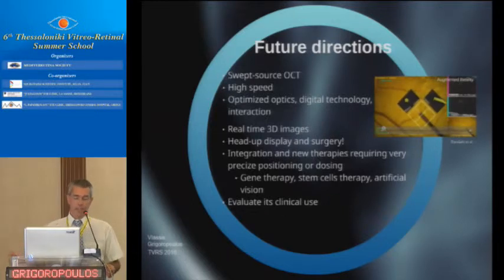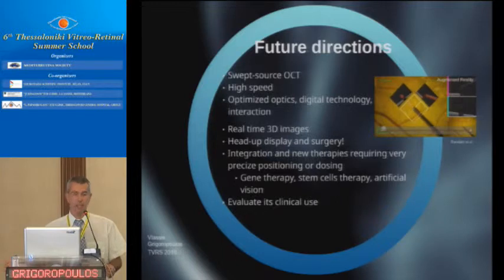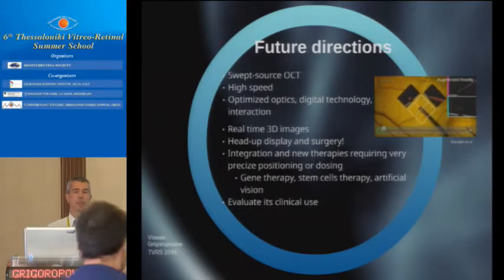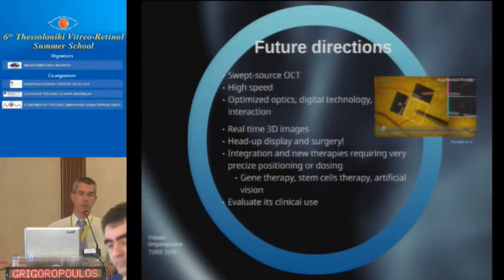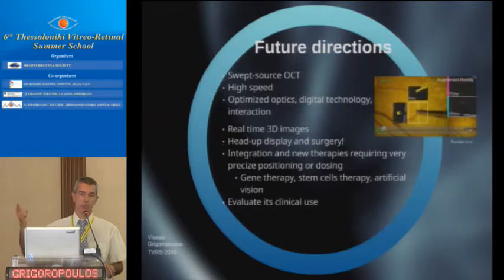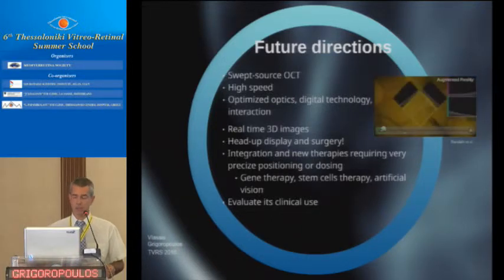And also, we are expecting to have real-time 3D images with a head-up display during surgery. For example, 2 years ago, we saw Eckhart in Germany doing real-time surgery without the eyepieces. He was only looking with the 3D glasses at the screen. He did the entire surgery like that.